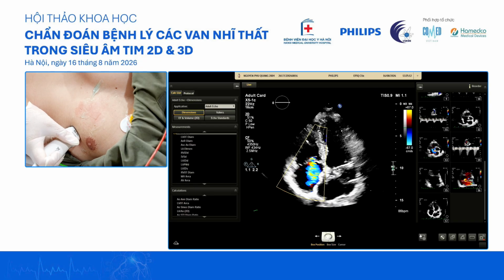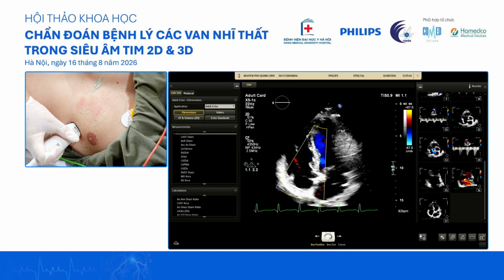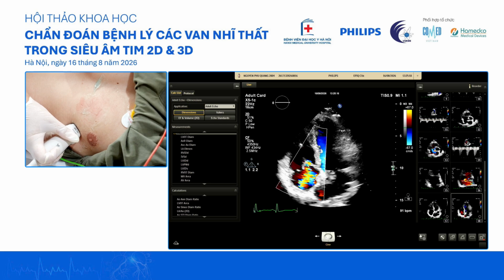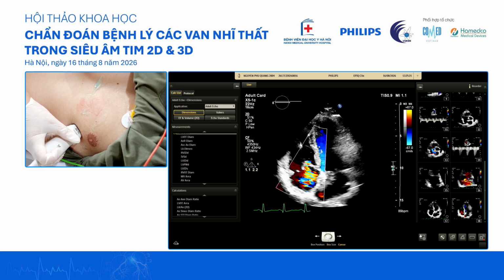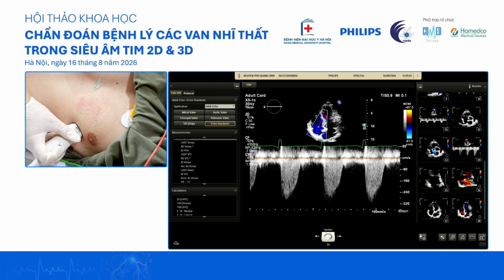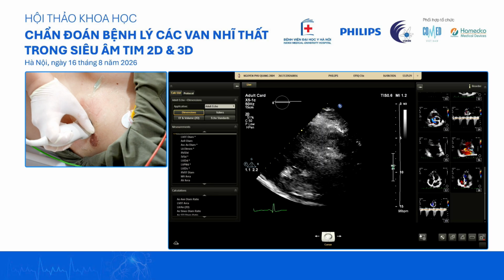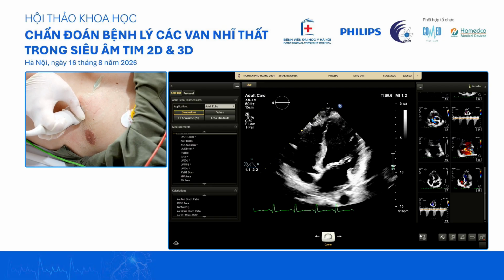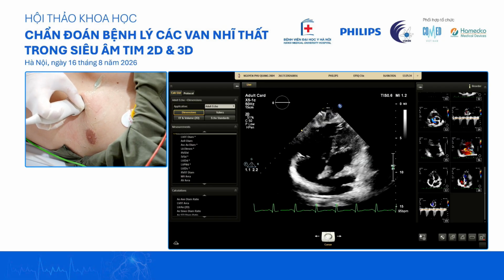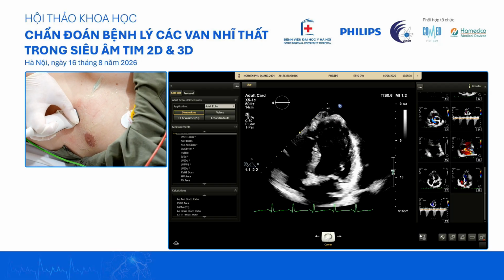And then we go straight to the right side to take a look at the regurgitation. Nhìn sang bên phải để đánh giá hở van ba lá. We will also do a little short foreshortened view. Chúng ta dùng các cái mặt cắt không phải mặt cắt chính danh.